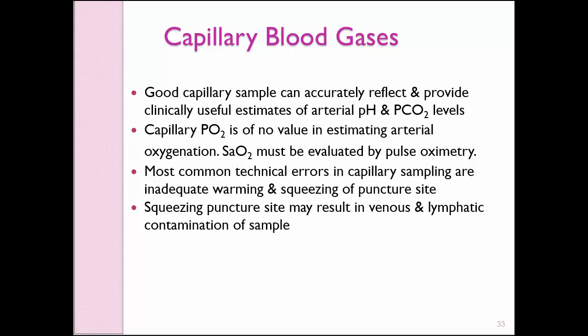One of the ways we evaluate newborns as far as blood gases is concerned is called the capillary blood gas. This differs a little bit from the arterial blood gas, in that the values are different, the technique's different, and obviously size on the newborn is a complication, where a lot of our needles are larger than their arteries. So if we went to stick them with a 22 gauge needle, we're liable to sever their artery. So many times in the nursery we resort to the capillary blood gas.